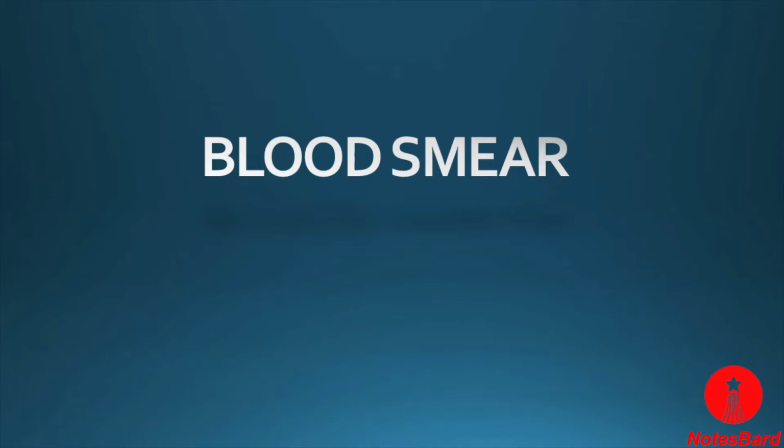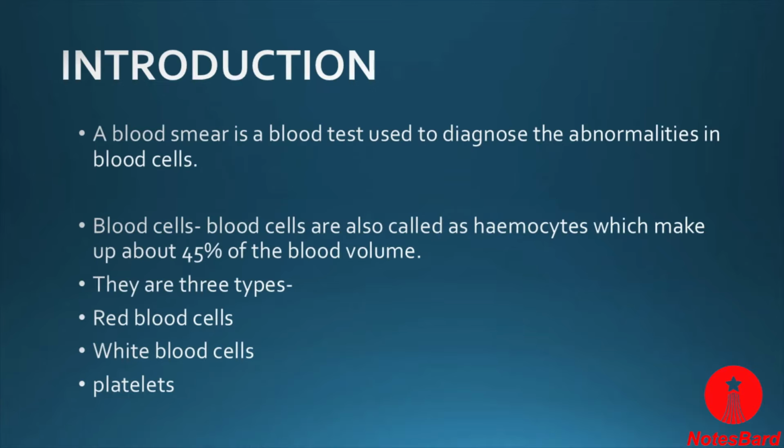So in this video tutorial we will discuss the blood smear. So let's start with the introductory part. So basically a blood smear is a blood test which is used to diagnose abnormalities in the blood cells. So let's first understand the blood cells.